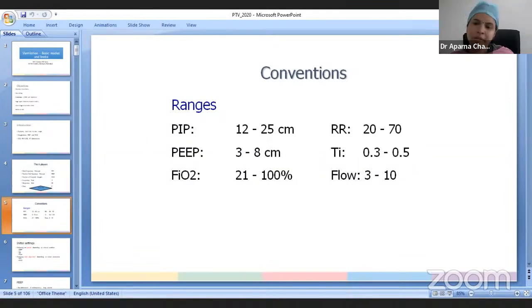And when you have the flow sensor, you can also measure the tidal volume, and we want the tidal volume to be 4 to 6 ml per kg in a ventilated baby. And intermittently, we will be assessing the PaCO2 in the blood gas. So these three parameters, clinically the chest rise and the bilateral breath sounds, and in the ventilator graphics, the tidal volume, which must be 4 to 6 ml per kg, and PaCO2 in the blood gas, these three indicate the adequacy of PIP.